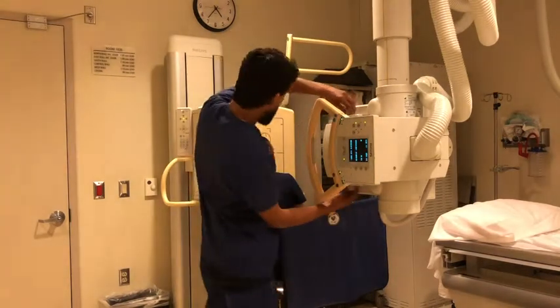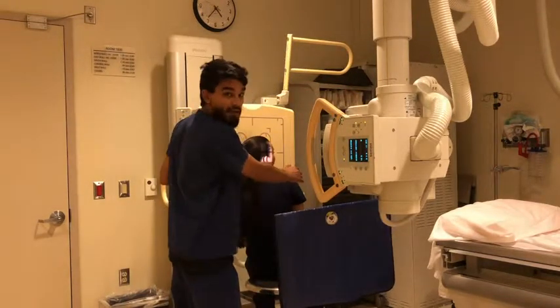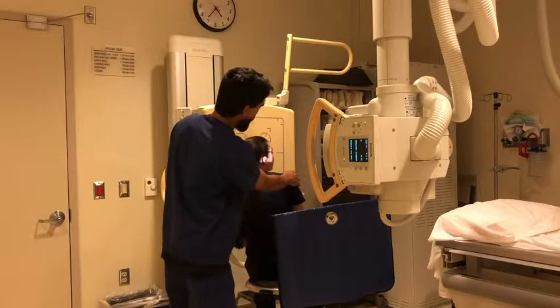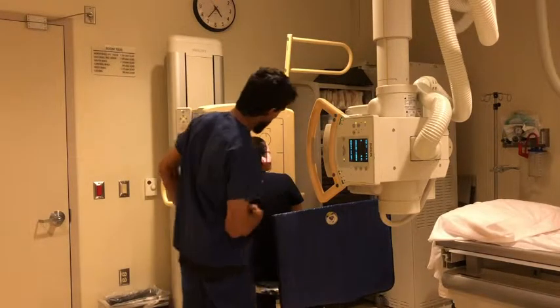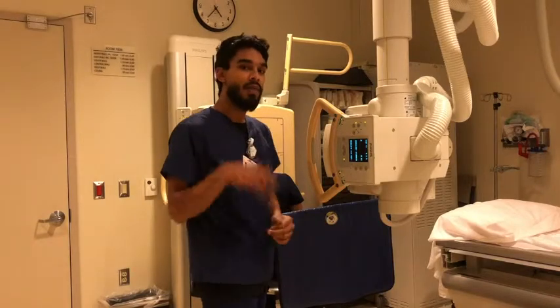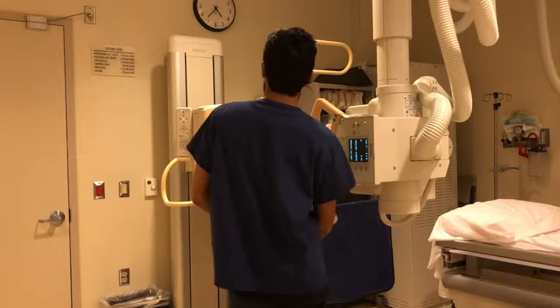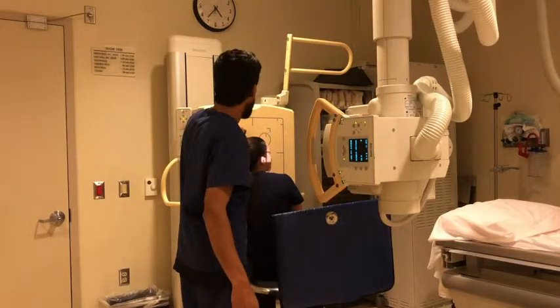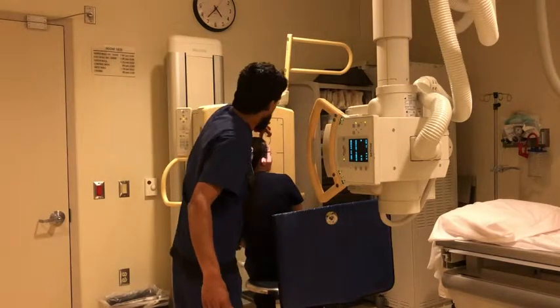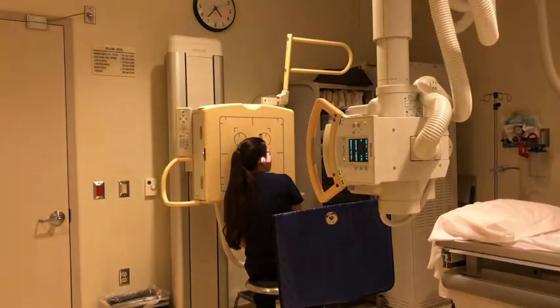Alright, so for this, we want the central ray to enter about 1/2 to 1 inch posterior to the outer canthus, and we're going to shoot this at 85 kV and 3 mAs. So I got my marker on the board, and we're ready to shoot the image. X-ray.